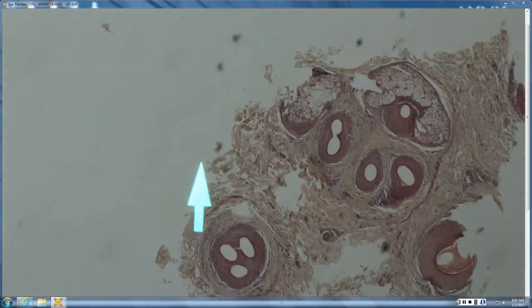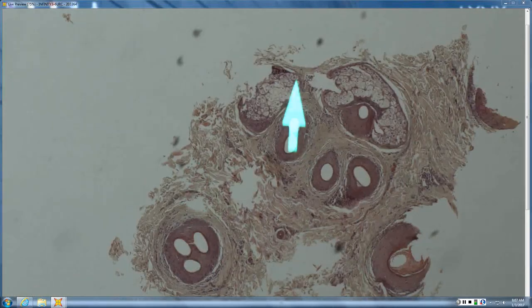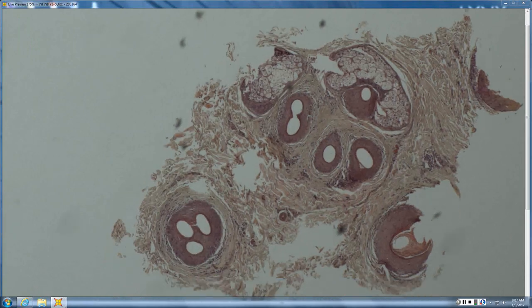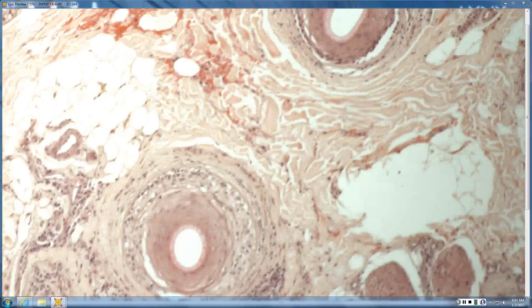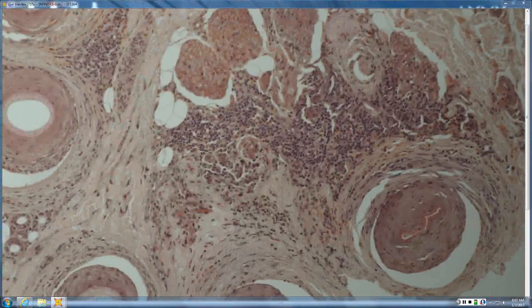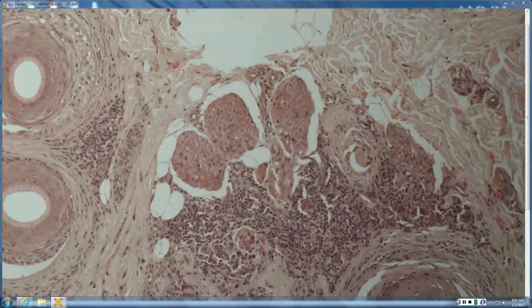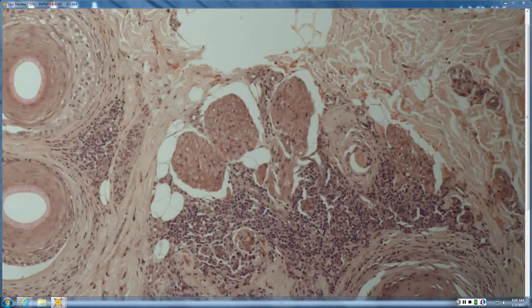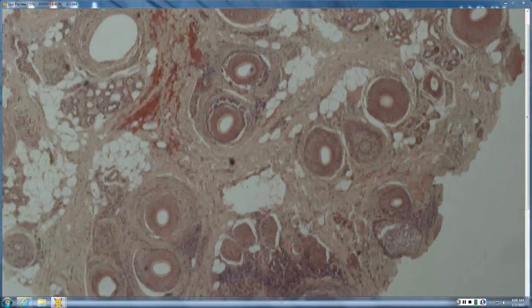And when you look at your hairs, I see some doublets. I see one triplet, but no six packs. My infiltrate looks mainly lymphoid, and the tendency more towards the doublet side than the six-pack side certainly goes with a lymphocytic rather than a suppurative alopecia. So what would your differential be?